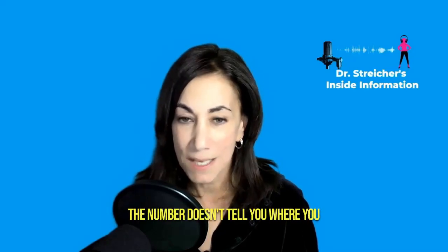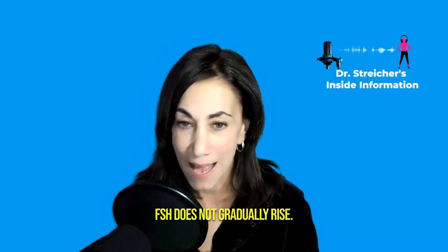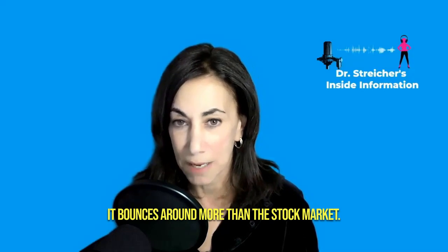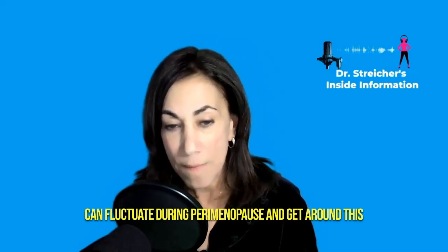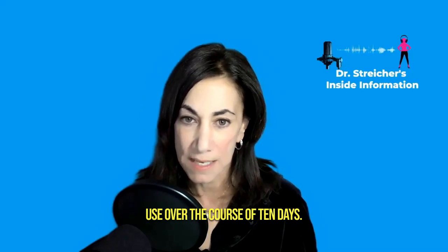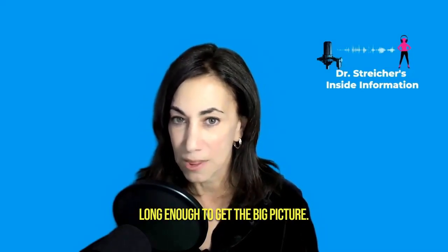The number doesn't tell you where you are on your so-called journey. FSH does not gradually rise. It bounces around more than the stock market. The Clear Blue people acknowledge that these levels can fluctuate during perimenopause and get around this problem by giving you 5 test kits to use over the course of 10 days. Except 10 days out of 1 month isn't long enough to get the big picture.